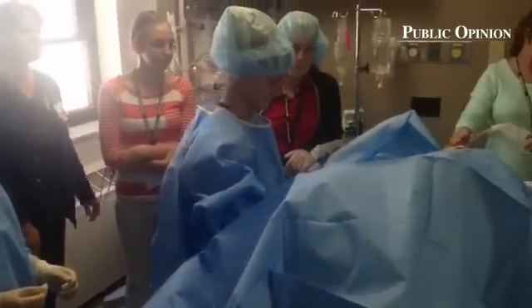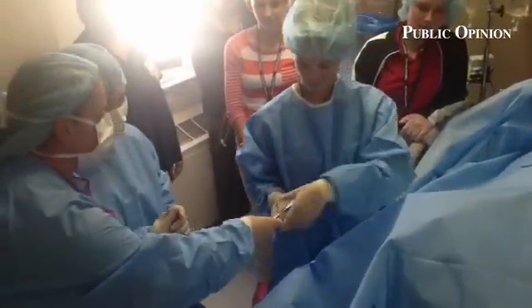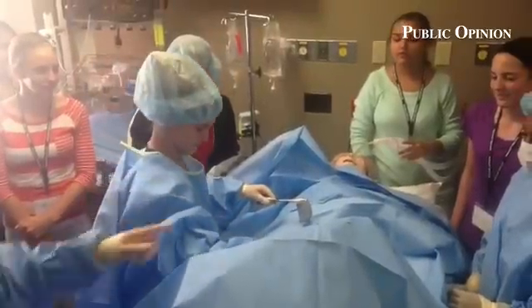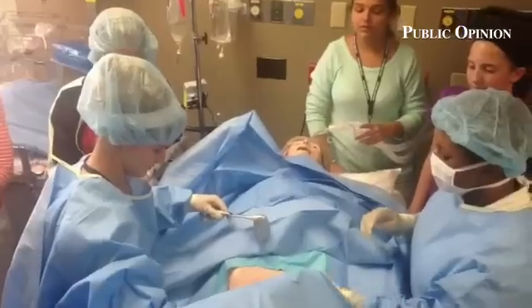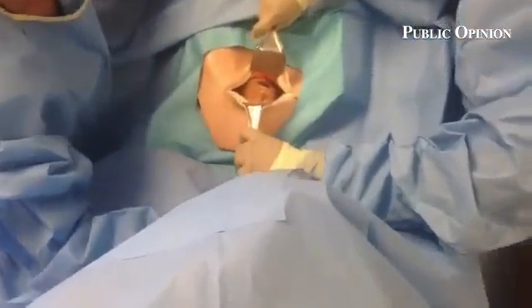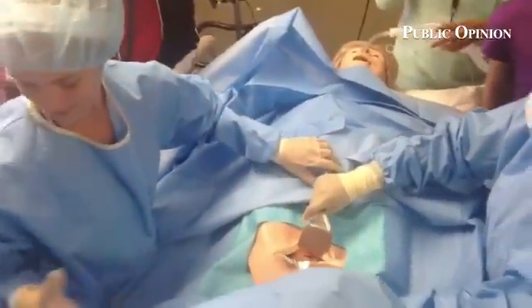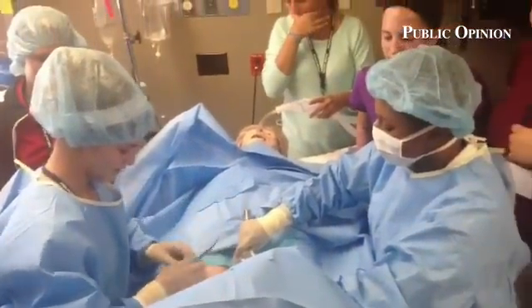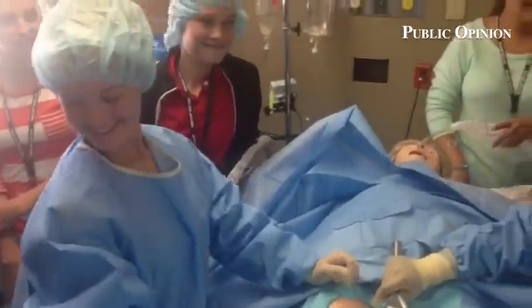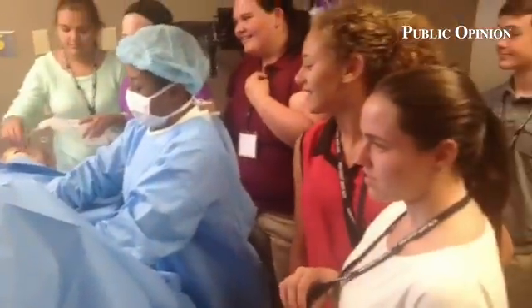Go ahead and make an incision — go for it. All right, next thing you're going to need — we're going to get some retractors. Go ahead and pull the skin back. There you go. Assistant, you're going to help with that. The doctor needs to see what's inside there.